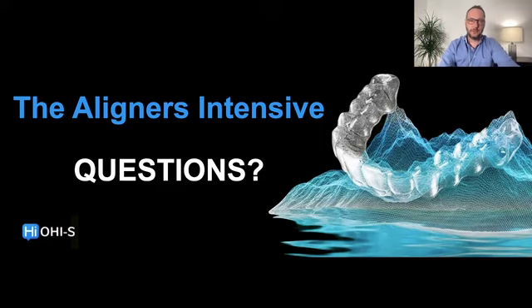And I use the protocol for DSD, Digital Smile Design, where I take 5 photos, okay. 2 of them frontal view, 1 full smile, okay, showing a lot of teeth and showing the bite open, so I can see the black behind the upper arch, okay. Then the frontal view in rest position, but in rest position with the lips open, like the patient when they are about to start talking, like this. So I can understand with these 2 photos the maximum exposure of the gums, if they are exposing or not, if we have margin to increase, intrude or not.